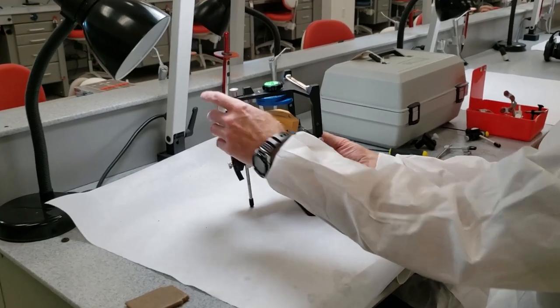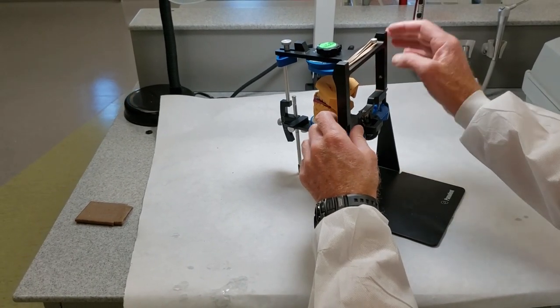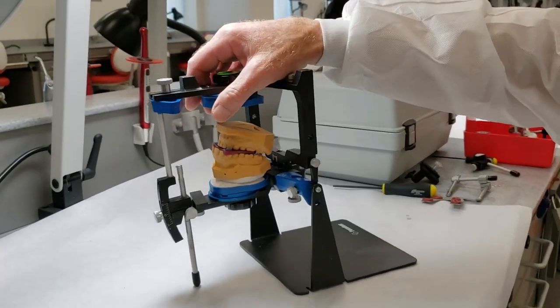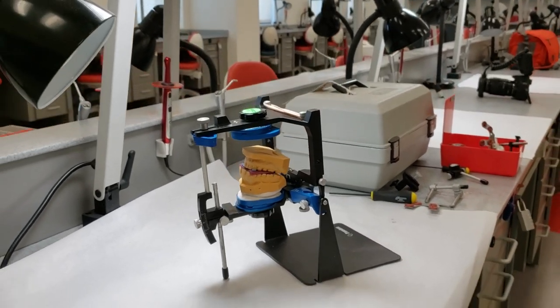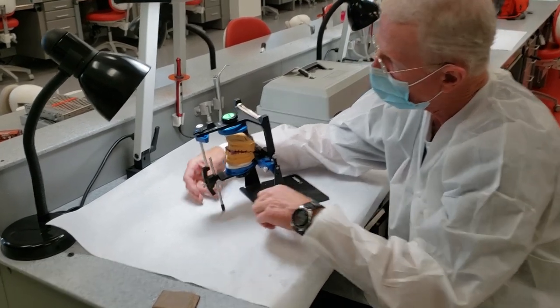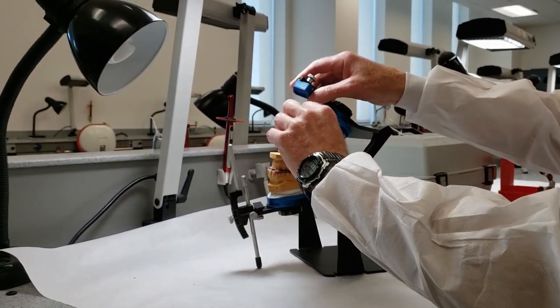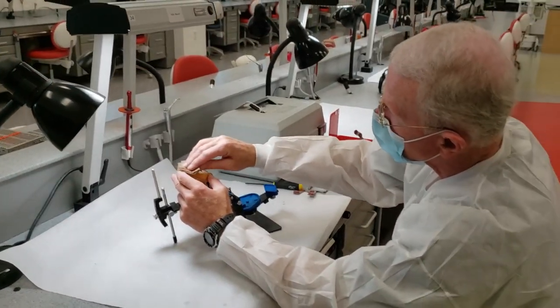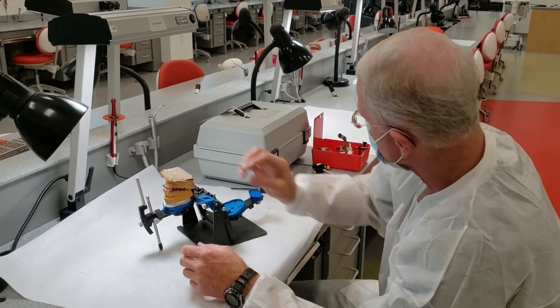Make sure that your centric lock back here is locked so that your condyles don't slide out of the centric relation hinging position. We'll re-wet that — there's a pretty good gap so I'm going to have to mix up a little bit more stone on this one. We may even drop this just a little bit so it's not tipping back too far. We'll set our wet paper towel back in place to make sure it stays moist — you just want it moist, not soaking, when you do the mounting.